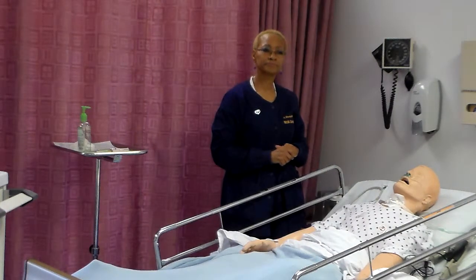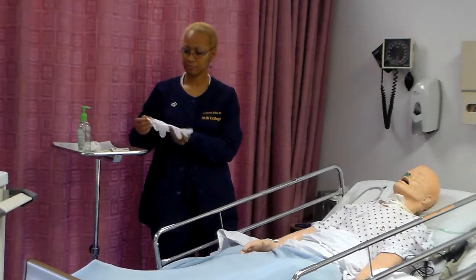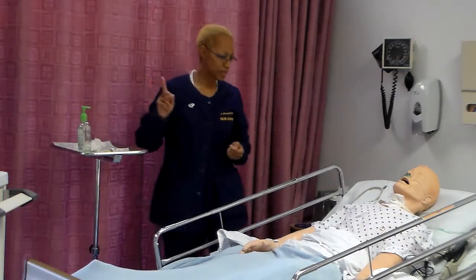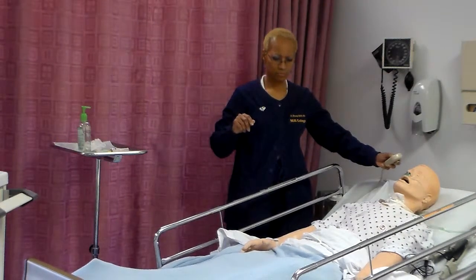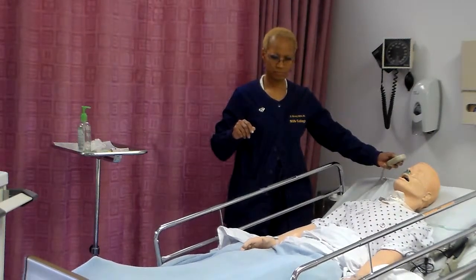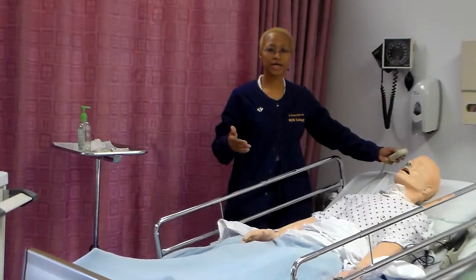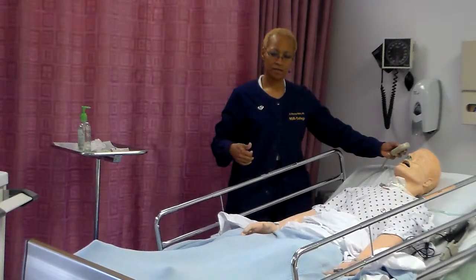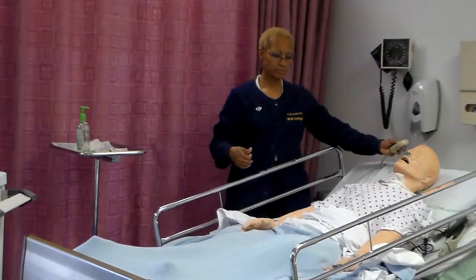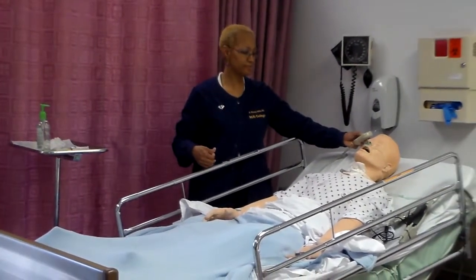Apply disposable gloves. Keep sheet or gown draped over body parts not requiring exposure. I'm actually going to raise my bed at this time, to a good working height. Remember, you always want to use good body mechanics when working with your clients. Save your back. You're going to need it for a long time.